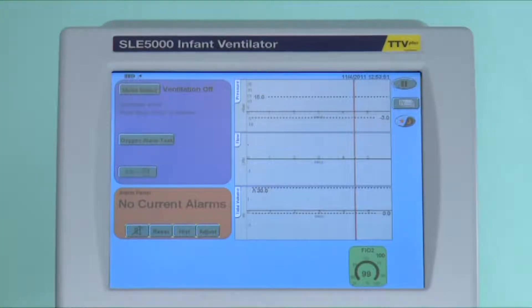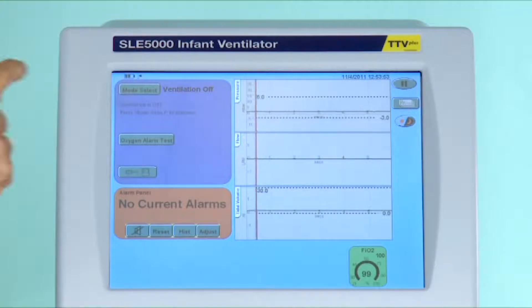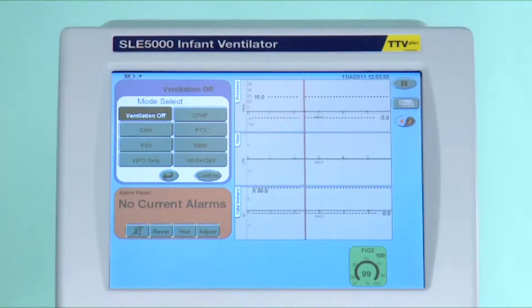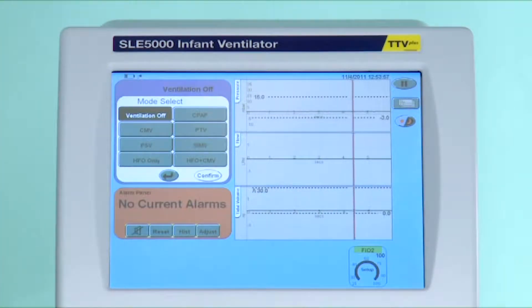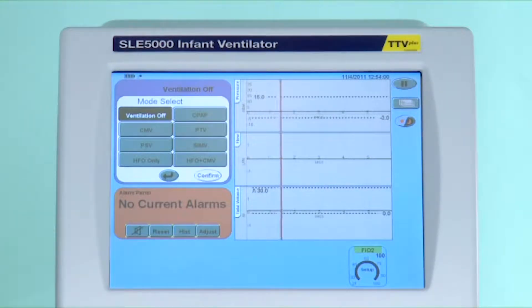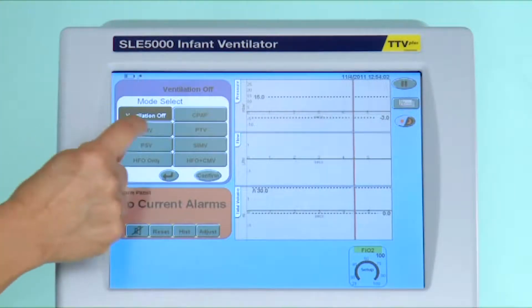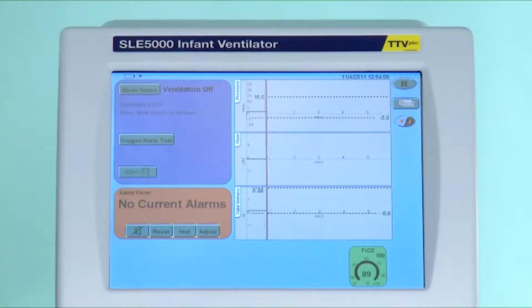In this screen you will select the mode you wish to use. The first mode is ventilation off, which is not truly a mode, but in this mode you can set up the ventilator as you want and calibrate the flow sensor. However, you cannot ventilate in this mode.